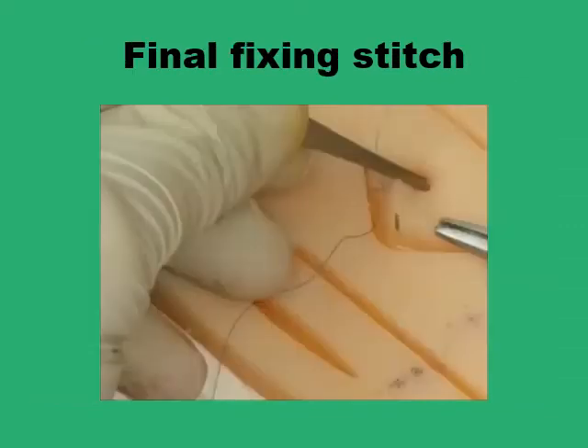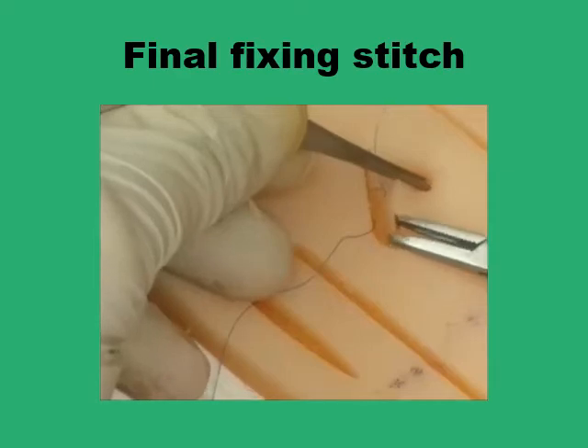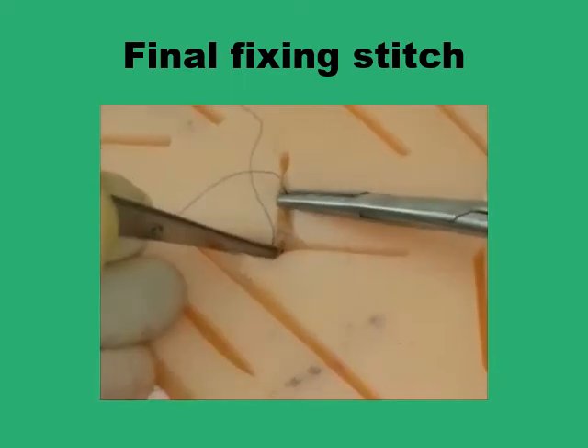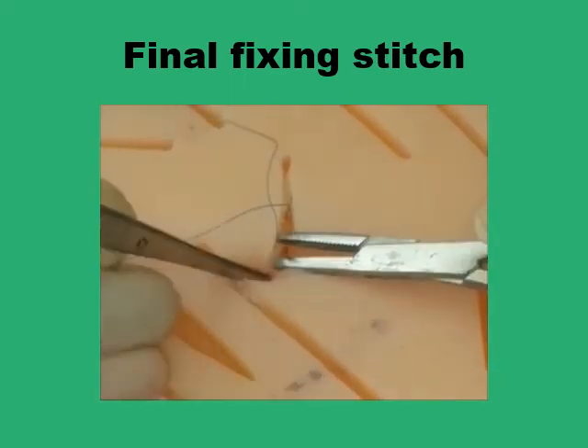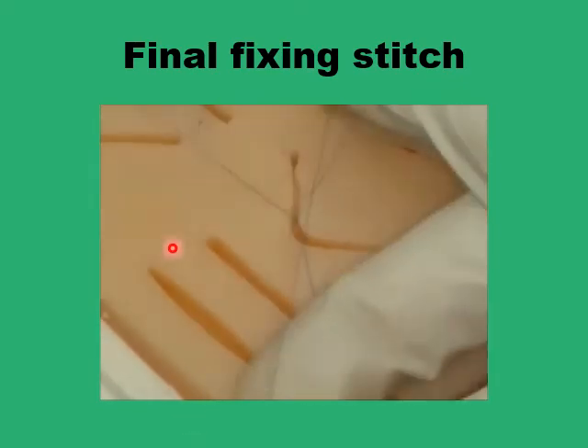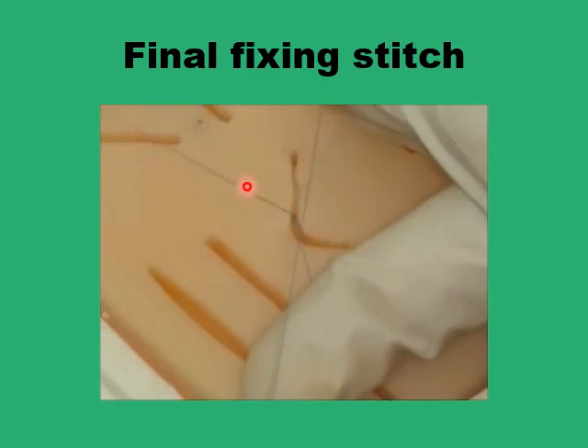The steps are straightforward. Once you finish the final stitch in the continuous line, you make a suture inside in the subcutaneous tissue, which is going to fix the entire suture line. So you take a bite in the subcutaneous tissue, retrieve the needle, and leave a loop of the thread on one side, and you have the free end of the thread with the needle on the other side — a loop between two fingers, and the free end with the needle attached on the other end.